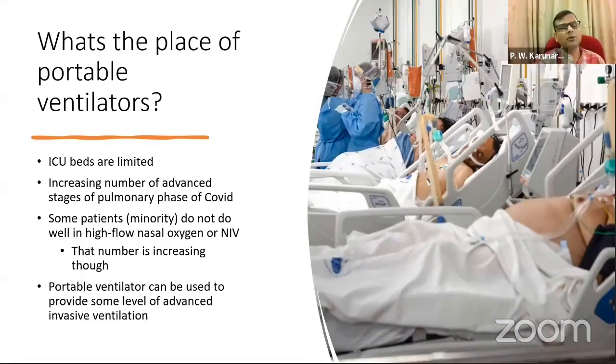Now, the good thing about the portable ventilator is that it is not a very intimidating device like an ICU ventilator. It has very basic settings, but at the same time it can provide some level of the sophistication of an ICU ventilator. Nowadays most portable ventilators can provide most of the ICU required facilities.